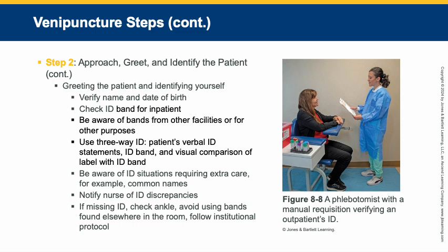Because that may mean that was a different patient and they haven't cut it off the bed yet, but they cleaned it and put a new patient in that bed. So if it is not physically on the patient, you can't count it. And follow institutional protocol for anything else that they have.